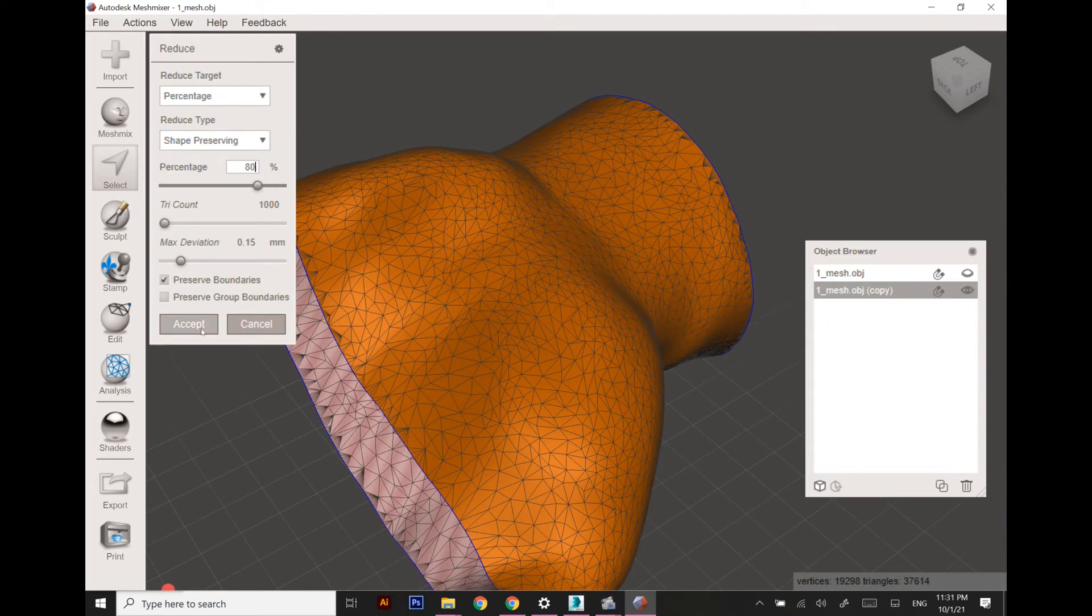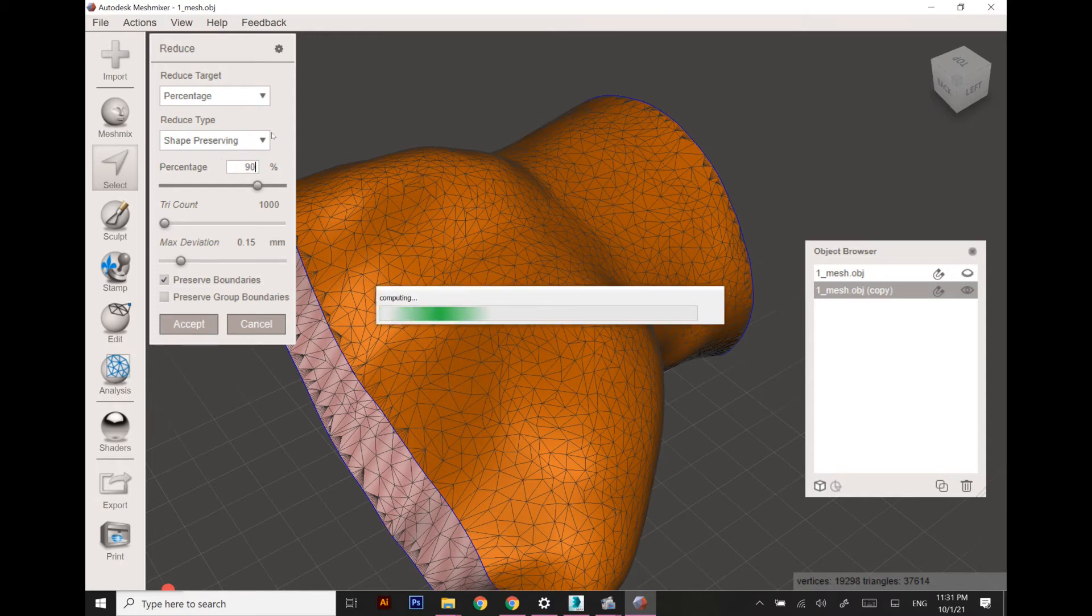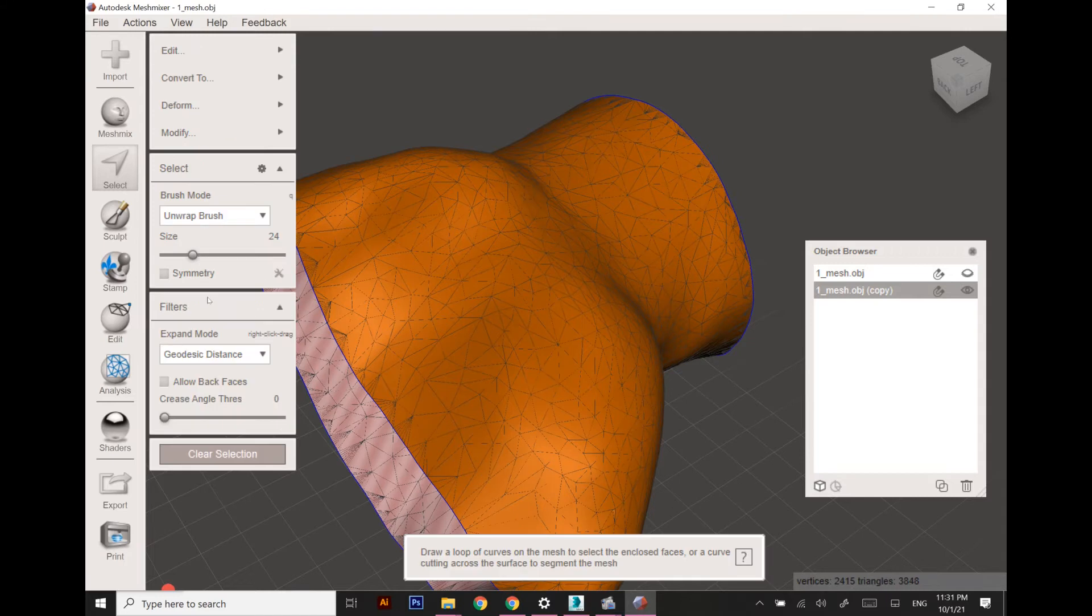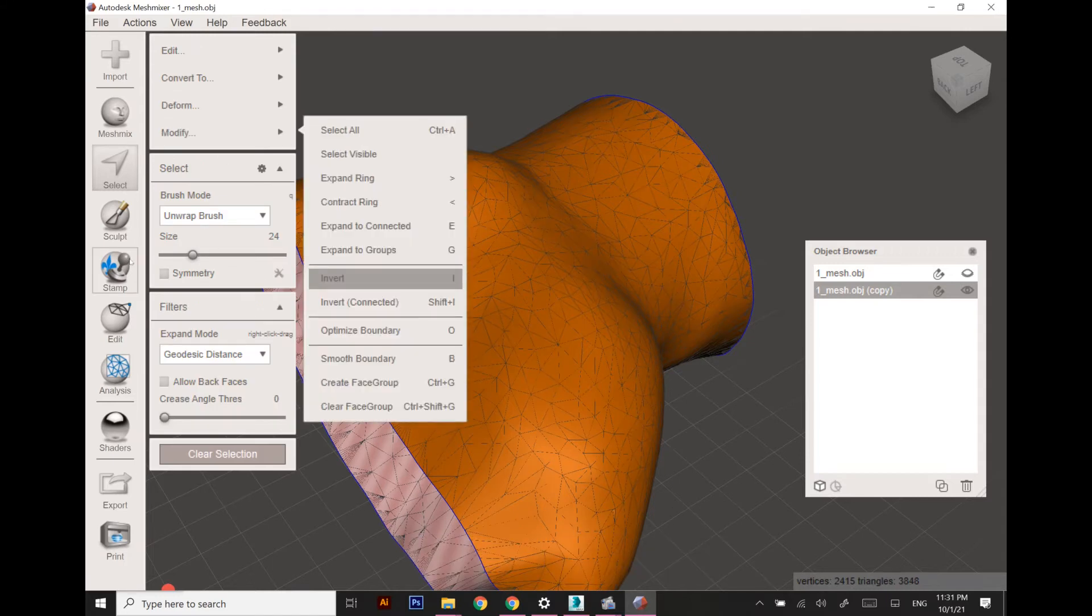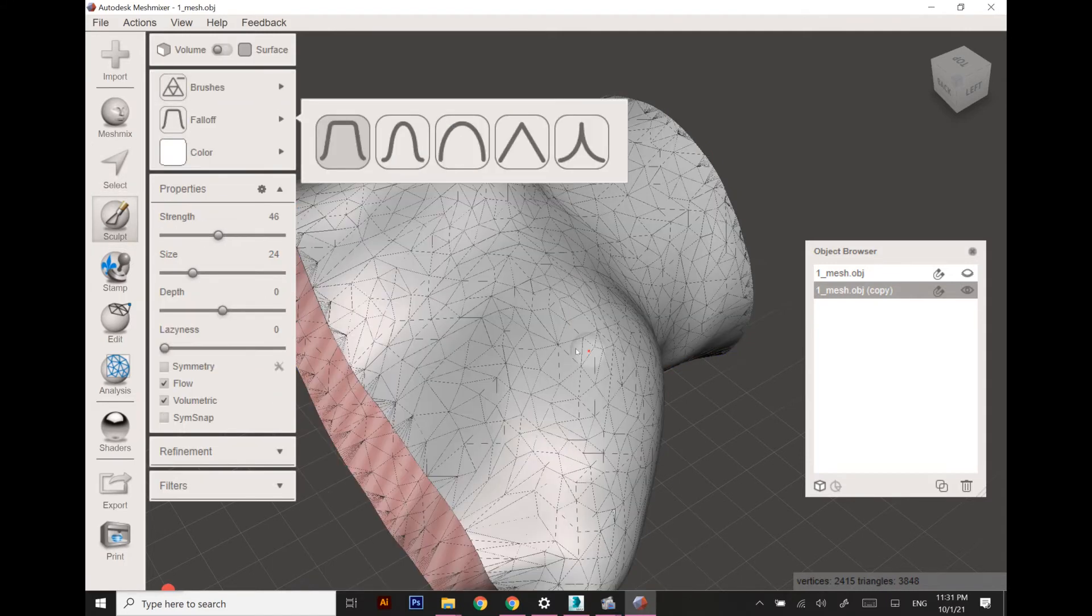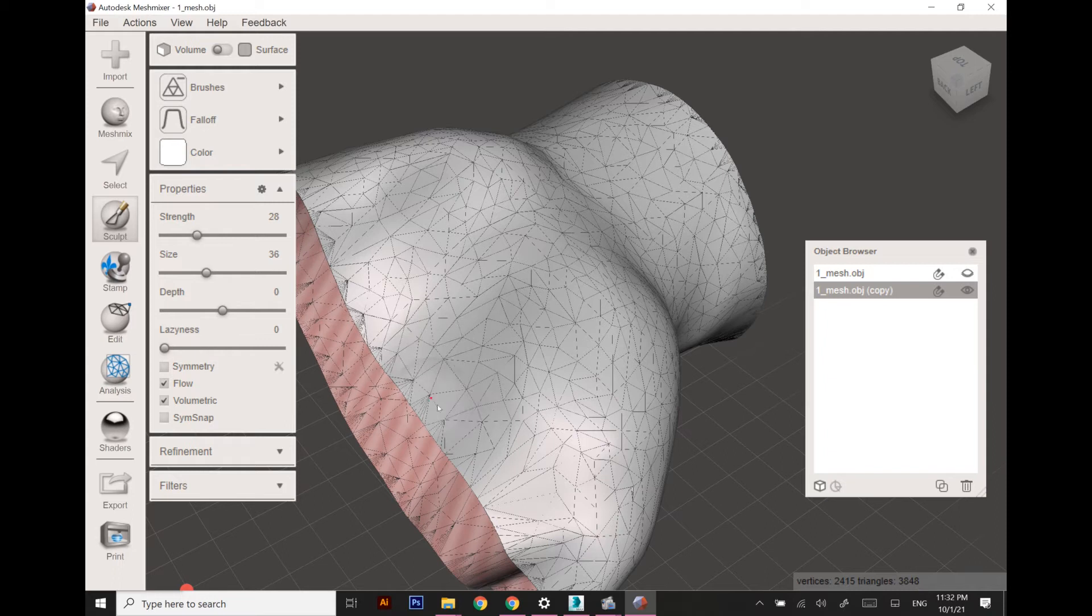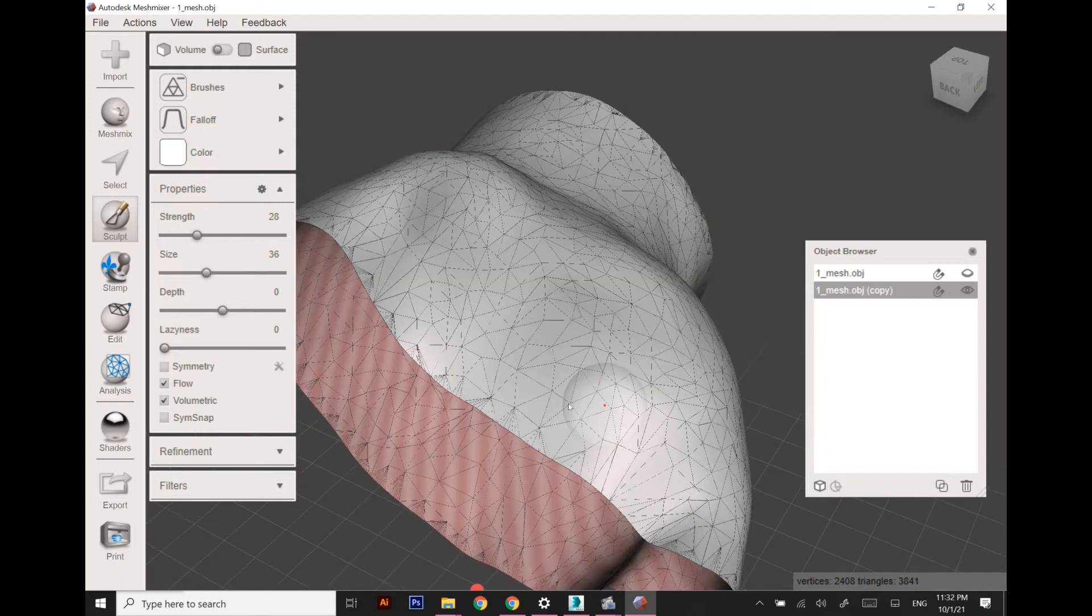As you can see on the corners, the polygons are quite rough and quite differently distributed, so I'm going to reduce the number of polygons by using the Adaptive Reduction brush.